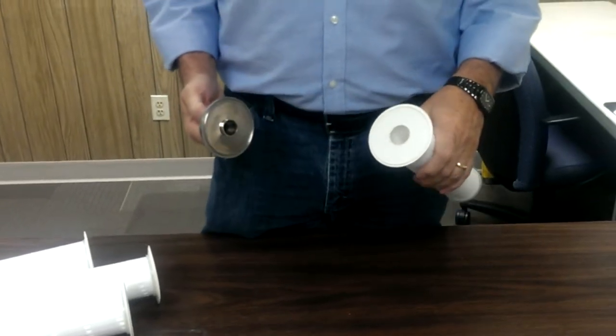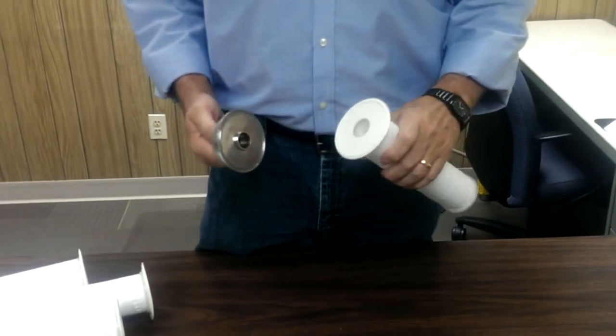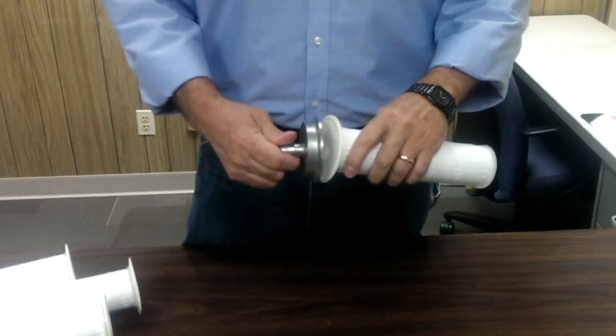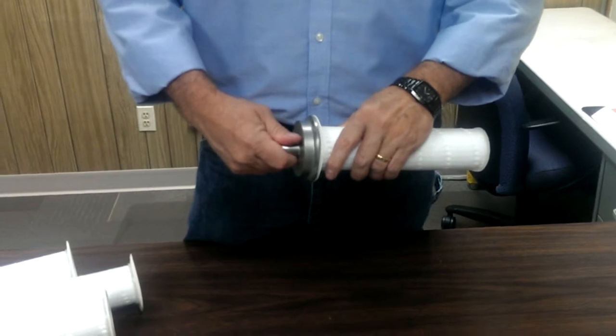This is the proper way to inspect the filters for CareStream Health. Take the stainless steel cap and your filter, and insert the filter cap into the filter.